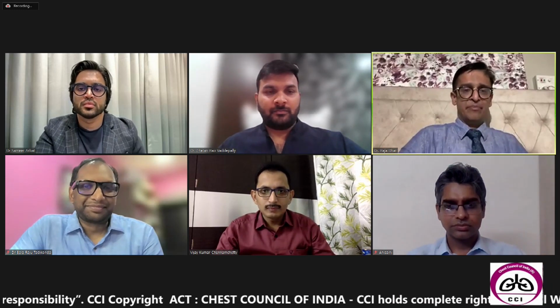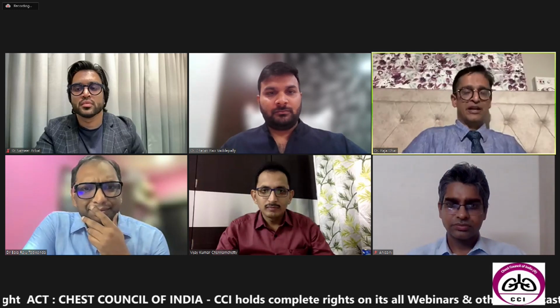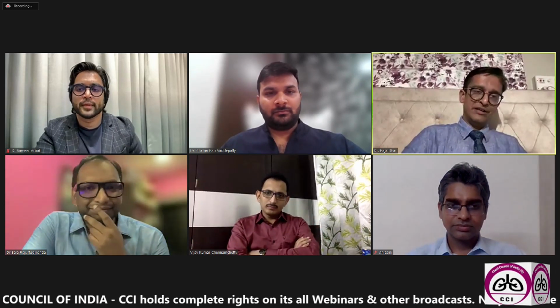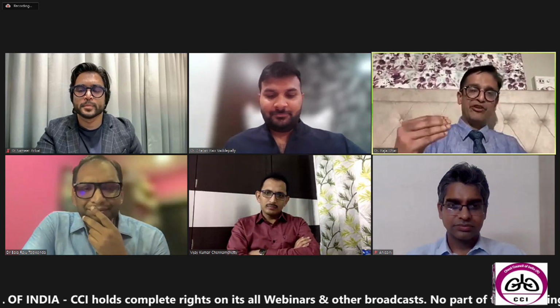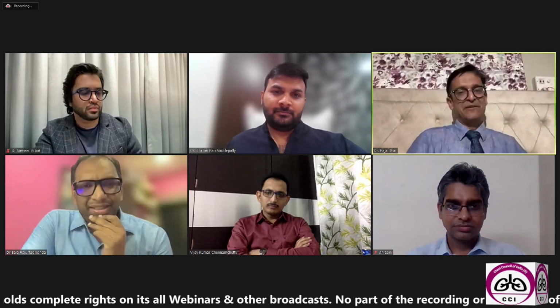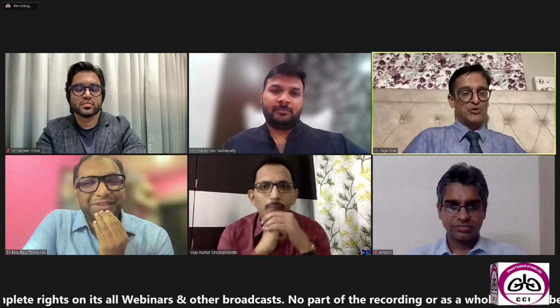Let me come to you, Bala, about opening up of stenotic segments. And I'm asking you this because you're probably the first ones in the country who started doing cryo. Is that something that you think was useful? Do you still use it? Opening up of stenotic segment, the freeze and thaw cycle of 5 seconds. Do you think that works, or do you think that's just hype about use of cryo when it started?